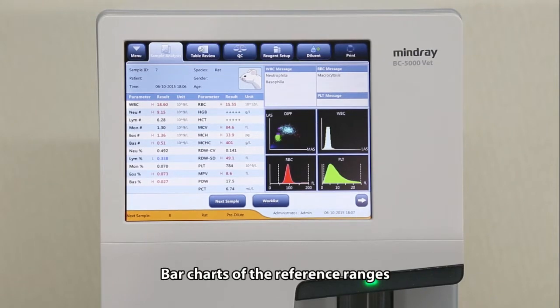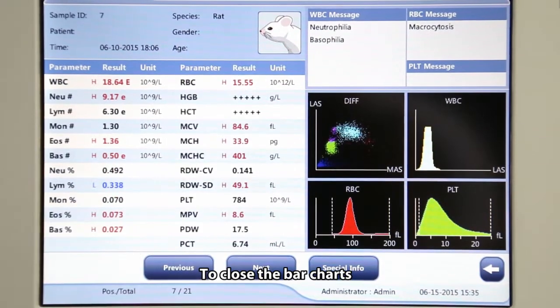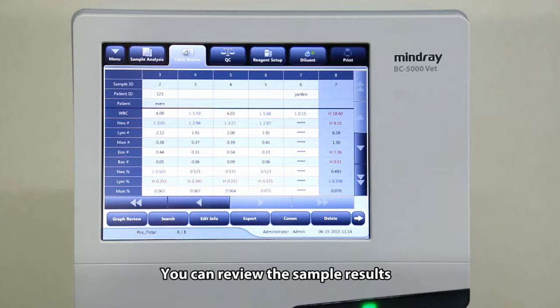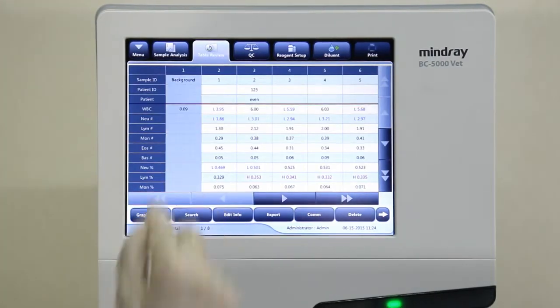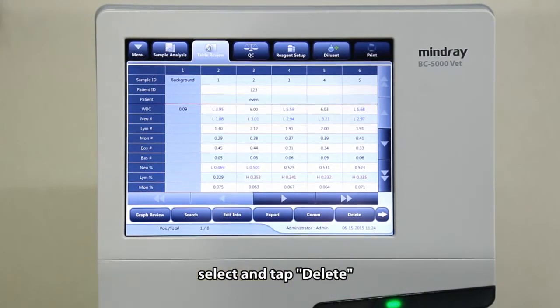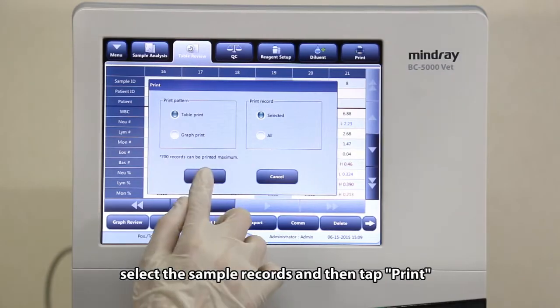Bar charts of the reference ranges can be shown by tapping the parameters. To close the bar charts, tap the parameters again. You can review the sample results either in tables by tapping table review or in graphs by tapping graph review. For unwanted sample results, select and tap delete. To print, select the sample records and then tap print.